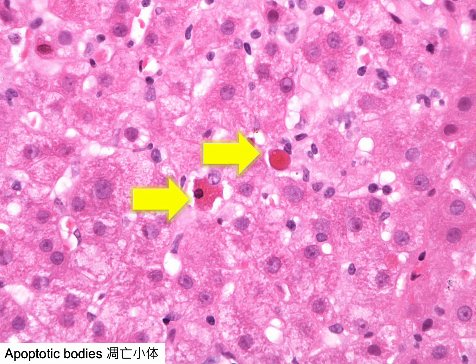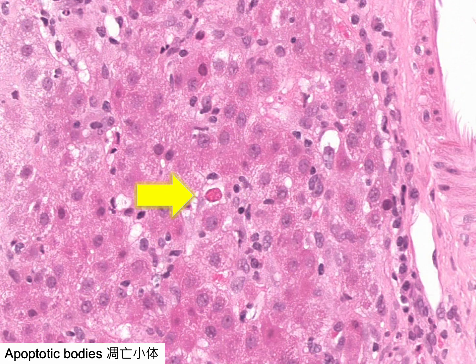An apoptotic hepatocyte exhibits a pyknotic nucleus and a shrunken, angular, hypereosinophilic cytoplasm. An apoptotic body, previously known as an acidophilic or Councilman body, is a small, mummified, rounded remnant of an apoptotic hepatocyte.